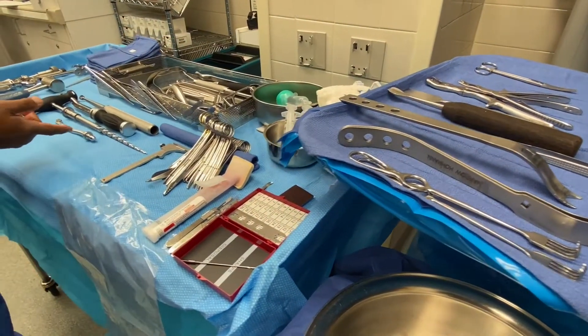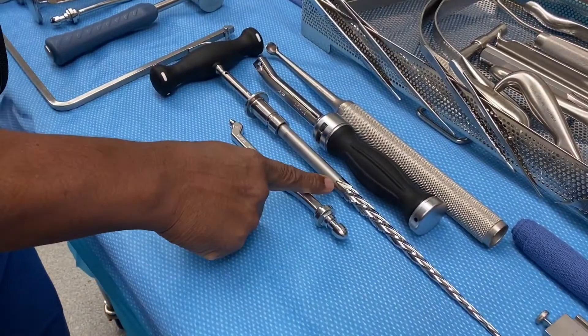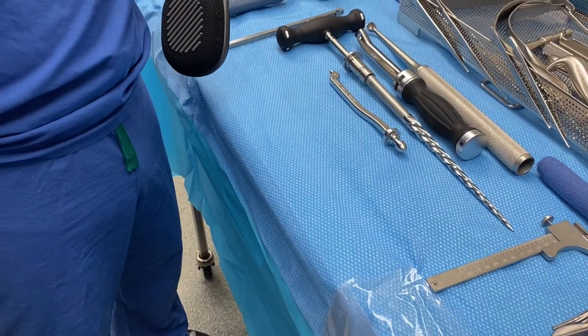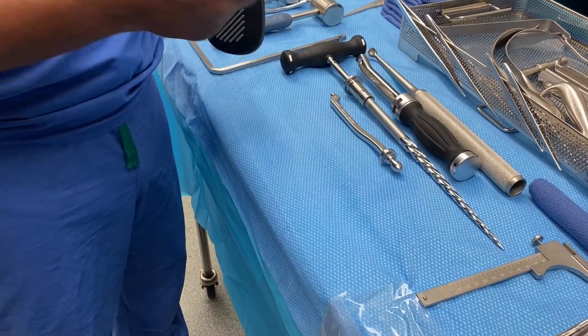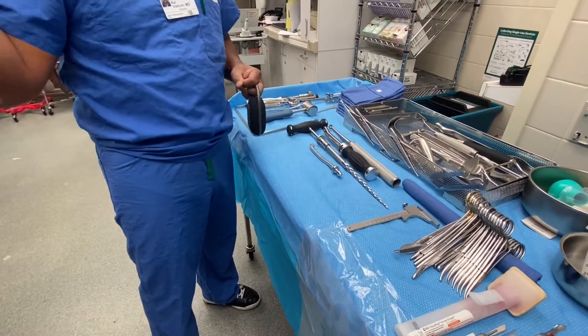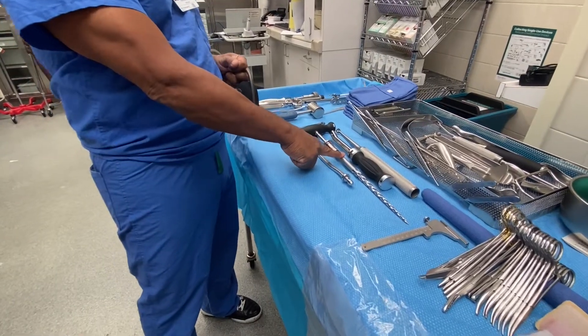The next thing is the box chisel. We do have a soft tissue protector — that wouldn't necessarily be needed for this patient because he's thin, but it's been ordered. With somebody who has a lot of soft tissue you need it, but with someone thin like this you can just push it down.